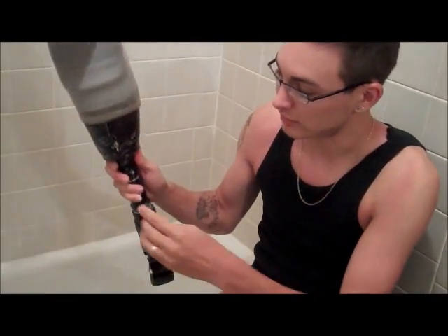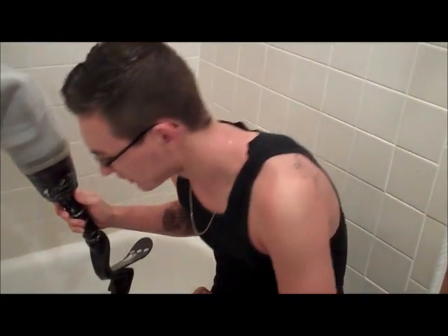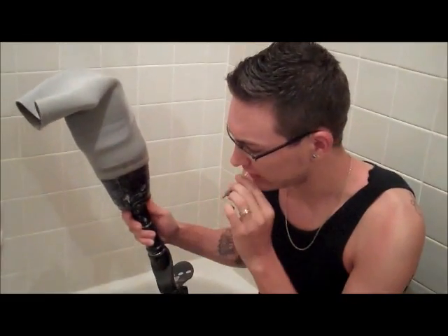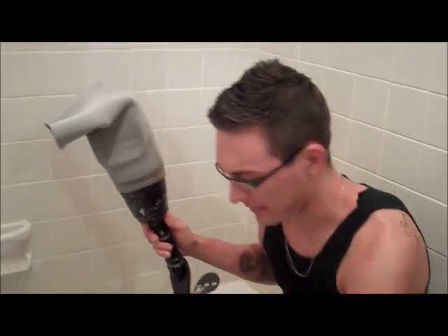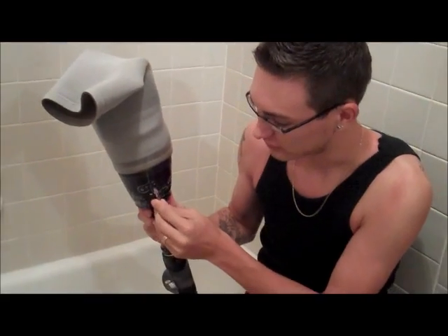I am going to clear my pump out and my valve. Yeah, that was salt water — that was gross. I did not think that through. Alright, I just blew all the excess out that I could. That's pretty much the best you can do there.